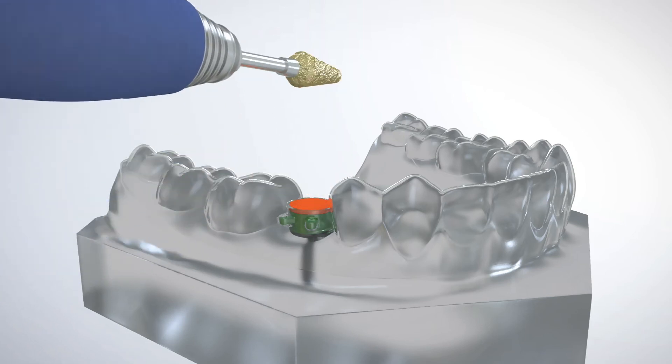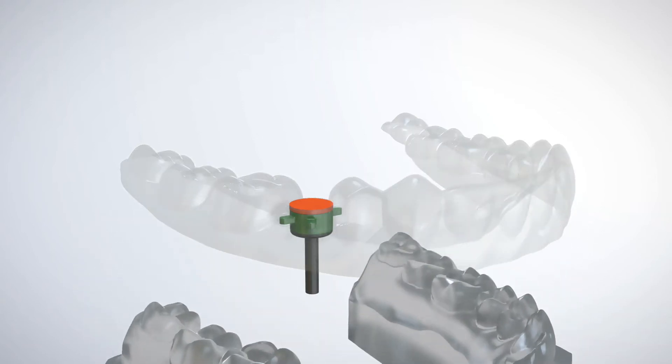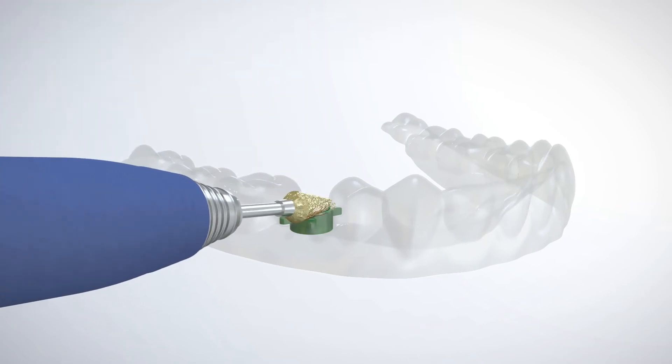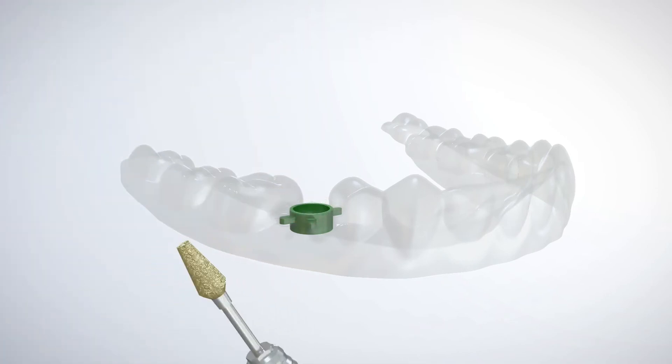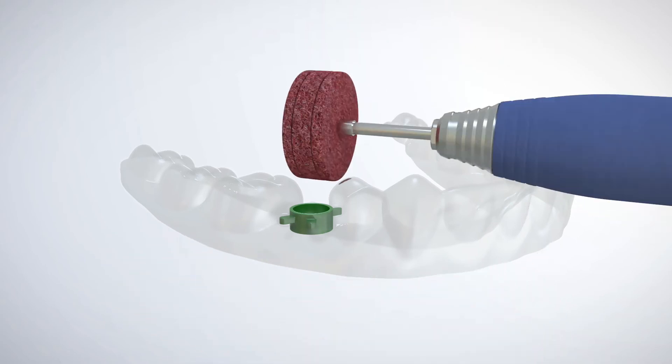The GRS surgical guide is removed from the model, followed by the locator pin and protection cap which is removed with light pressure. The GRS surgical guide is trimmed to accommodate specific surgical requirements, polished, and placed back on the model to confirm fit and stability.